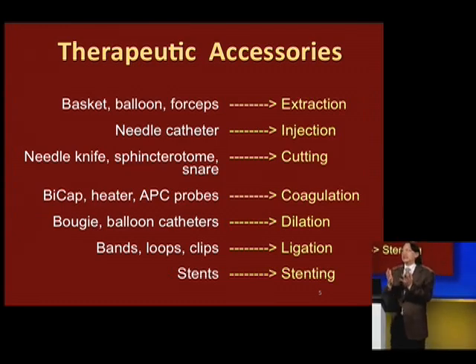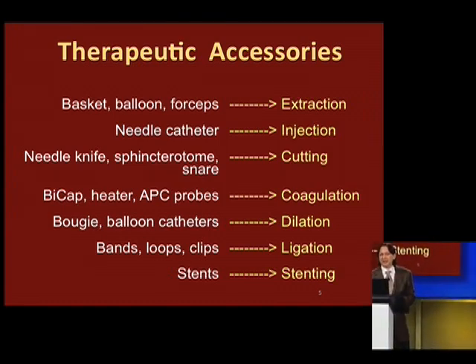And this has really been the stage over the past decades, the development of therapeutic accessories. And you can see there is a wide array of accessories that we now have available to us. They're all shown here on the left. Allows us to extract, to inject, to cut, coagulate, dilate, ligate, and stent. These are all the possibilities that have blossomed over such a short period of time.